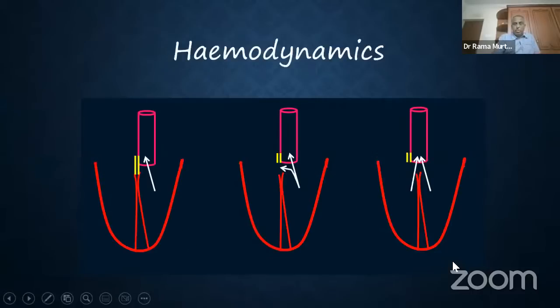Okay, so hemodynamically, what does it mean to us? It means that the aorta is committed only to the left ventricle in situation 1, that's normal. In situation 2, the aorta is committed only to the left ventricle, but the left ventricle also shoots out blood and perhaps receives blood from the right ventricle through a bidirectional flow through the VSD. Whereas if it's malaligned, you will have both ventricles which have access into the aorta, and therefore the aorta is committed to both ventricles. So that is the hemodynamic implication.